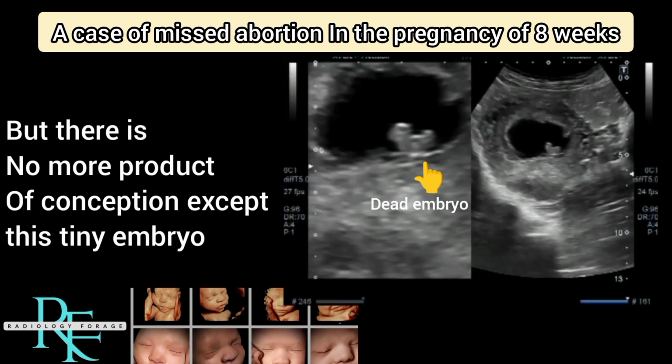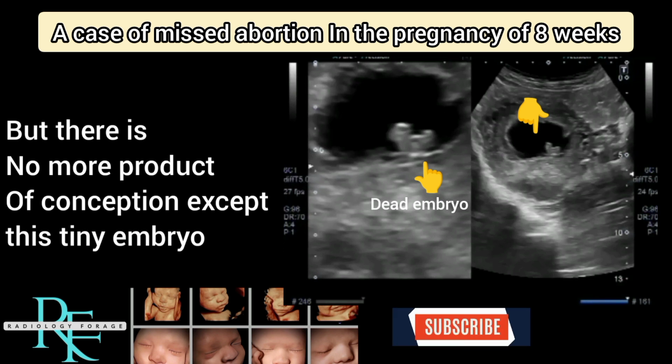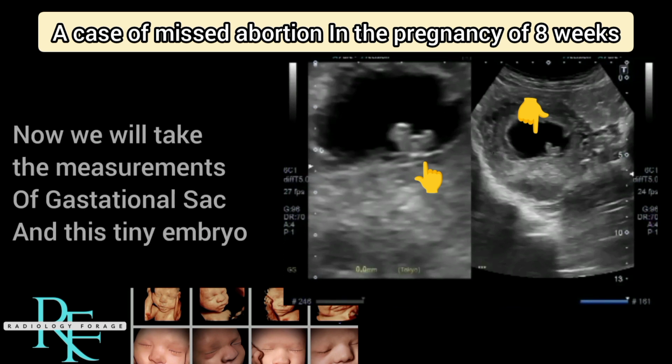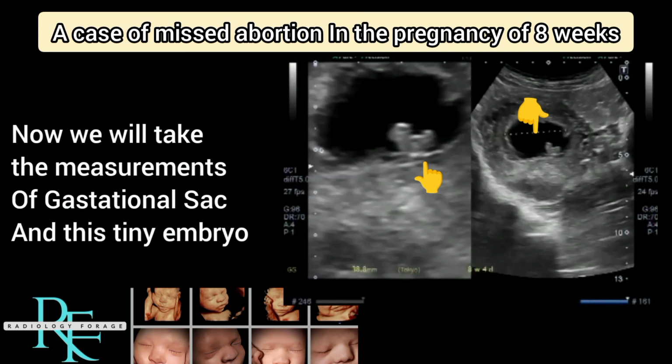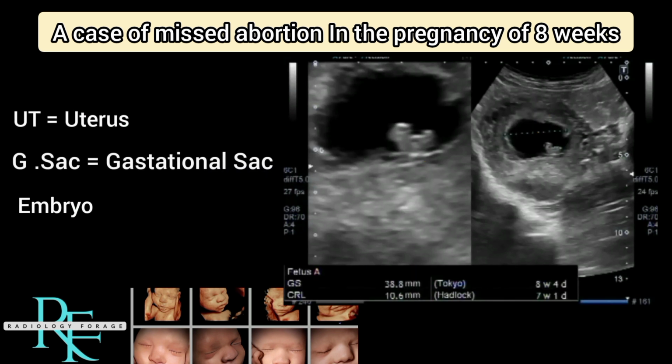You can see on left side there is a dead embryo and right side there is a gestational sac. Now we will take the measurements of gestational sac and this tiny embryo. This is the measurement of gestational sac and this is the measurement of small embryo.